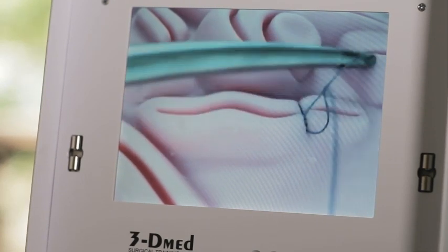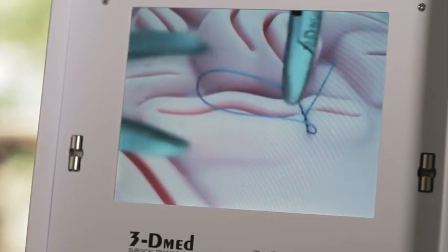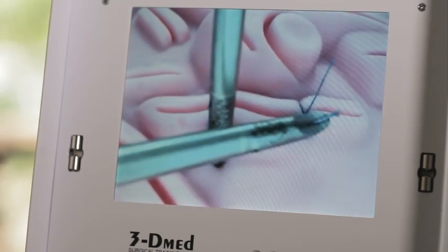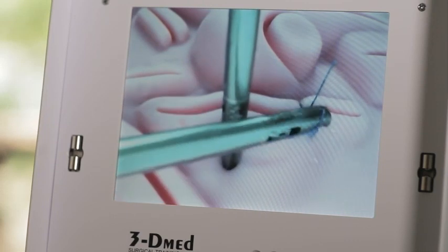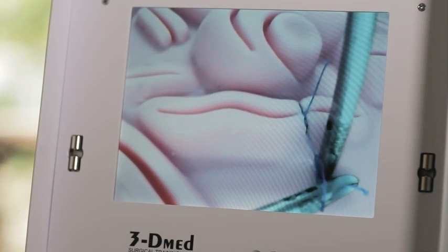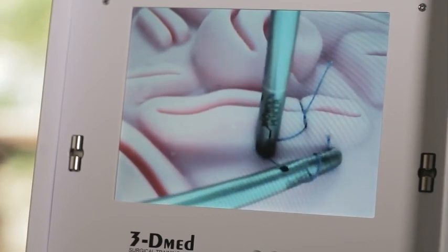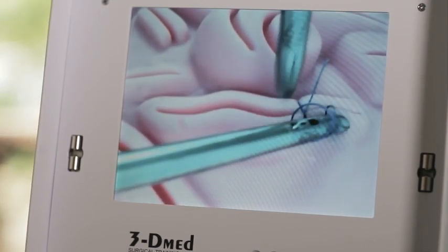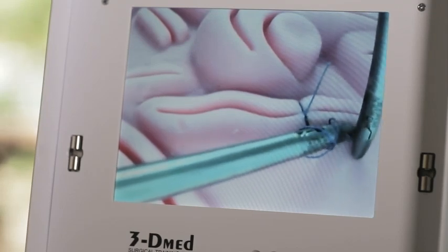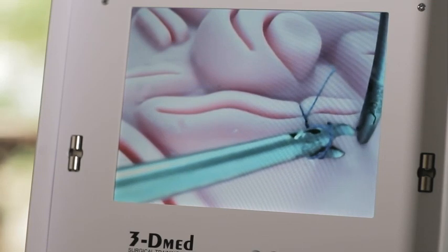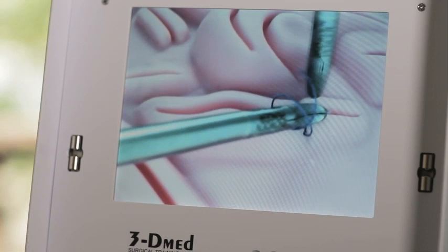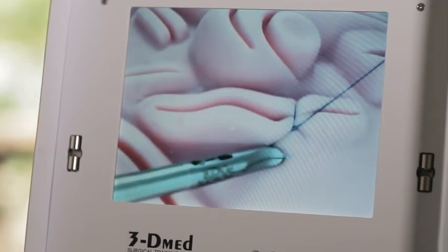We put a surgeon's knot in there so it'll stay, then we will repeat the same procedure in the other direction. We won't need to do a surgeon's knot. I'm going to go one wrap farther than I need to so that this time when I pick up the end of my suture, I can take it off the end without worrying about losing my wrap and there we go.